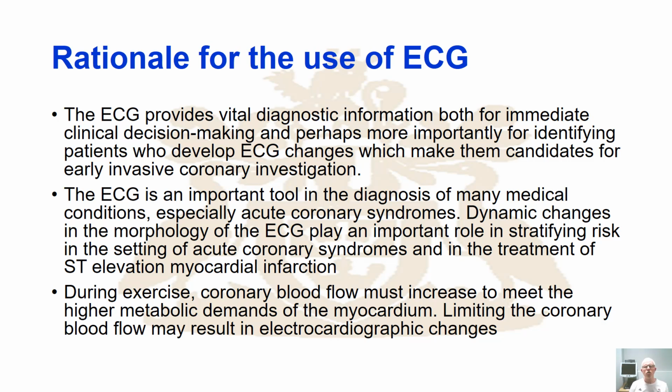So having these controlled conditions under exercise is really fundamental to being able to understand the way in which the heart is operating. So we have a really solid rationale for using ECG, both in a resting condition and also under exercise conditions, or controlled exercise conditions.